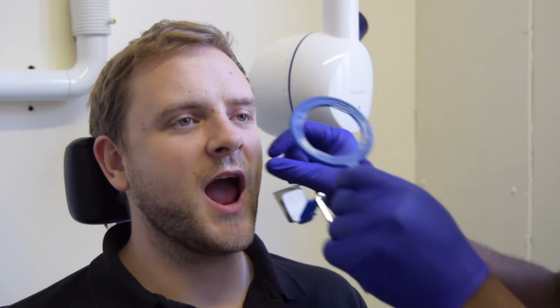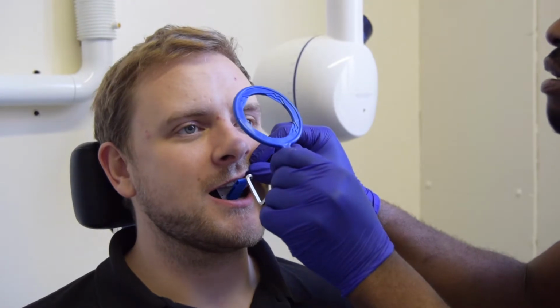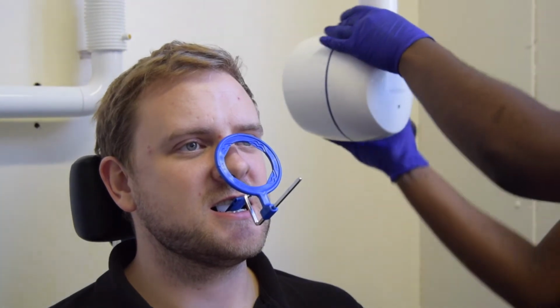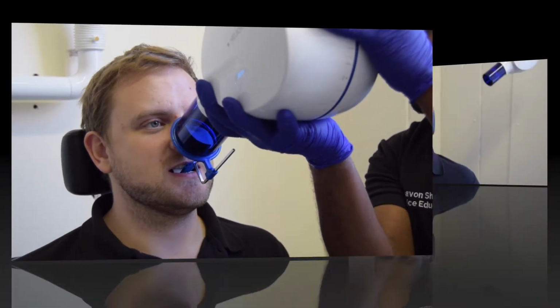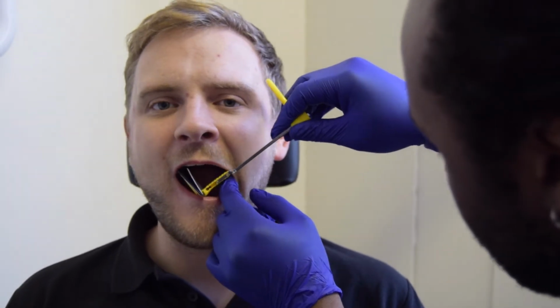For extraoral views, the procedure should be explained to the patient, including warning them not to move during the investigation, and to remove spectacles, dentures, earrings, or facial jewelry to reduce the risk of image artifacts. Intraoral image receptors should be positioned carefully to avoid trauma to the soft tissue. The radiographic investigation should be carried out as accurately and quickly as possible to avoid repeat investigation and to lessen patient discomfort. The patient should always be watched throughout the exposure to check that he or she has followed instructions and not moved.